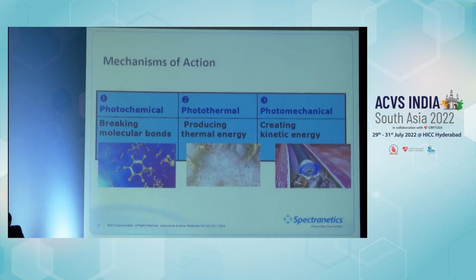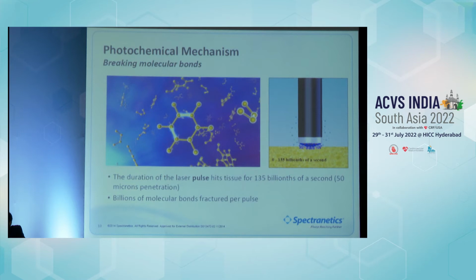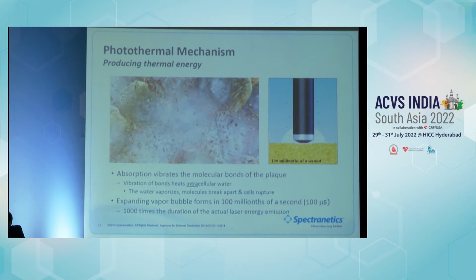Just coming to the mechanism of action, it has a photochemical action, it breaks molecular bonds; it has a photothermal action and produces thermal energy; and it has a photomechanical action, it creates kinetic energy. The photochemical mechanism is breaking the molecular bonds, that is how it acts. The duration of the laser pulse is 135 billionths of a second, with 50 microns penetration. So billions of molecular bonds are fractured per pulse. This is how the photochemical mechanism acts.